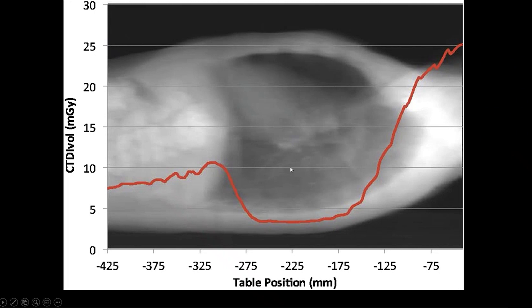The lungs are air-filled, so we don't need as much radiation. Areas which are denser here in the upper chest and neck, we have more radiation. Then the amount of radiation goes down. Then it comes back up a little bit as we get into the abdomen. So this is the idea of dose modulation.